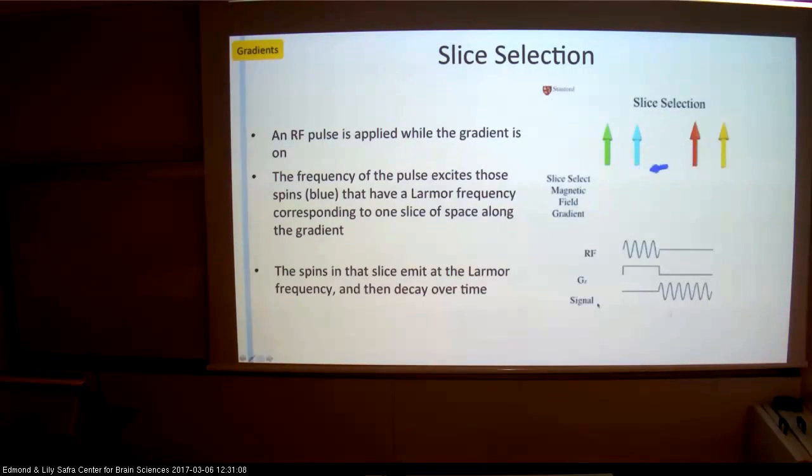So manufacturers will try to make them stronger and stronger. But the main effect is that if you turn it on and off very fast, that's one option. You can actually do it long, which makes your scan very long, and you're going to get very nice resolution. Or you can turn on and off very fast, but to very high amplitude, and that might create a SAR effect, so warming the tissue, which we're also not allowed. So that's the limitation.